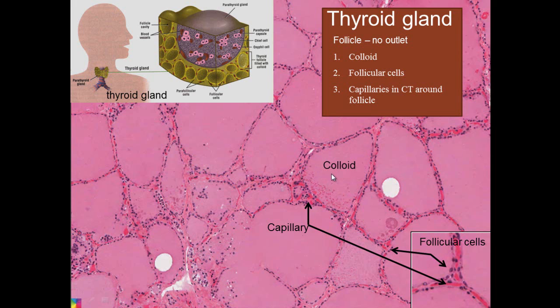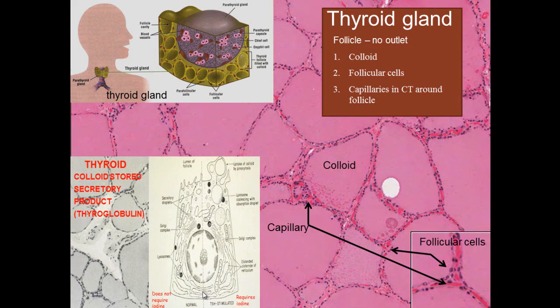So this is a follicle, colloid in the middle, and the cells in there are the follicular cells. These are the cells that, whenever they are stimulated by thyroid stimulating hormone, cause thyroid hormone to be produced. There's actually an A and B component of these follicular cells. One side they produce colloid, which is what we see, and with iodine, that colloid should be iodinated. If it's iodinated, then it can be broken down to the thyroid hormone.